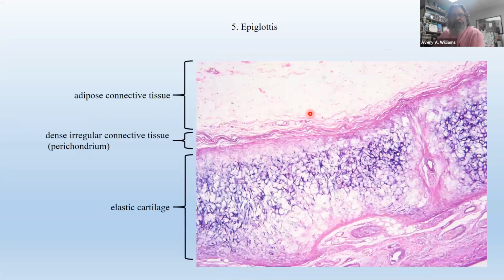This slide right here shows you some of the connective tissue. Beginning, well, let's look down here. This is, I guess, the most important one in the center. That's the elastic cartilage. And you can tell, first of all, it's cartilage. All cartilage has one characteristic that's hands down cartilage. All cartilage has these pits. You see these little holes? They're called lacunae, L-A-C-U-N-A-E. That's the plural for the word lacuna.